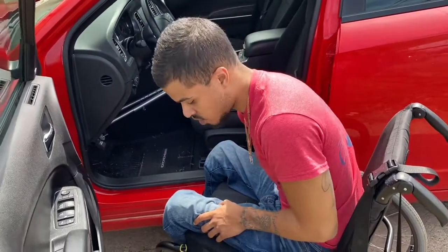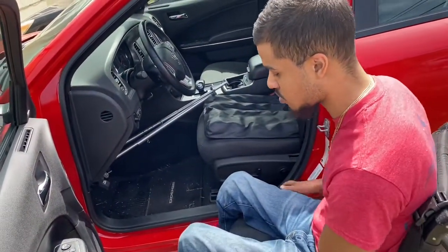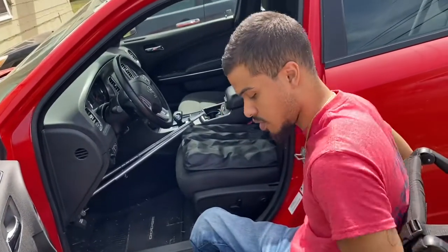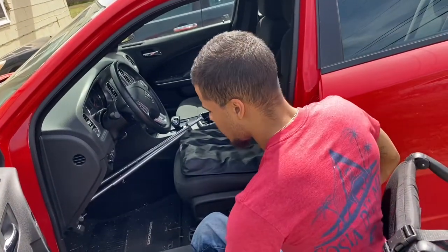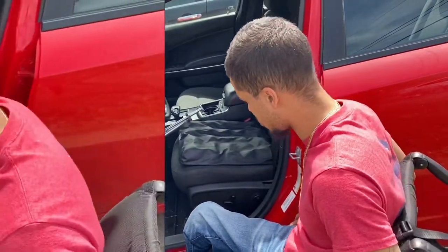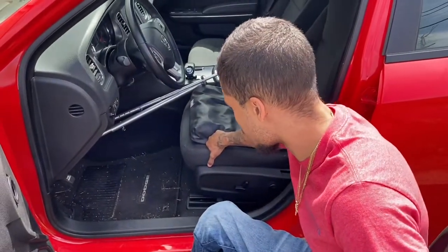I lock both wheels when I do it just so the chair doesn't roll out from under me. Some people do it without locking the wheels, but I like locking the wheels. And I push off the wheel too when I do it instead of pushing off the seat. If you don't lock them, the wheelchair's gonna slide and roll all over the place. I like to just ball my fist up. I got a cushion in the seat, but I like doing the opposite seat actually so it's more firm.